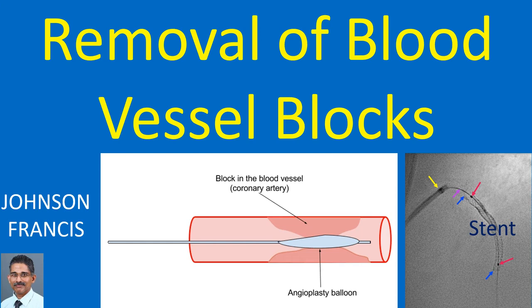First part of the discussion is on angiography, the procedure for locating blocks in blood vessels, and the second part on angioplasty, the procedure for removal of blocks.